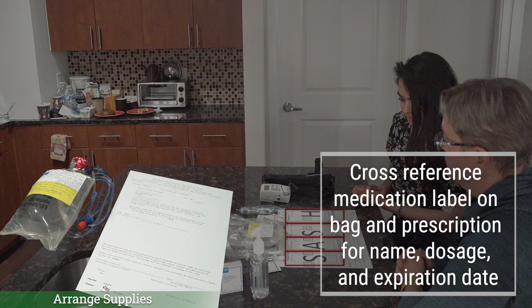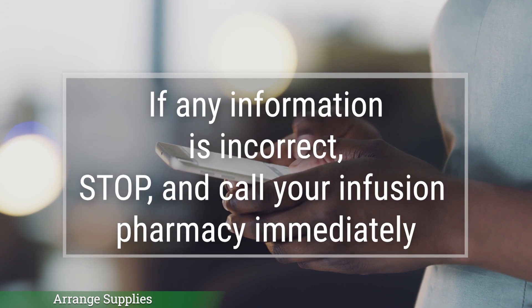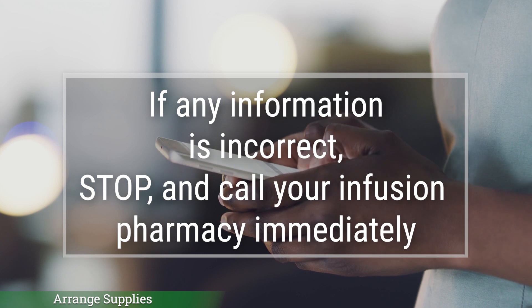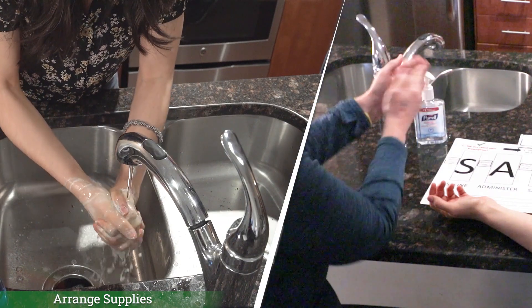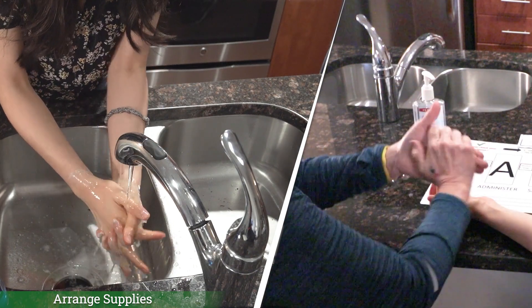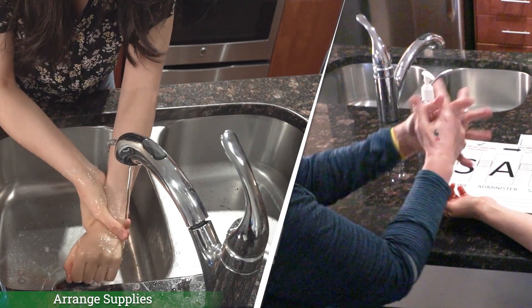Now, check the label on the medication bag and compare it to your prescription. It is always important to check the medication label on the bag to make sure that your name is correct, the medication and the dose of medicine is correct, and that it matches what is on the prescription. Look at the expiration date or the do not use after date on the medication label. If any of this information is incorrect, stop and call your infusion pharmacy immediately. Now, wash your hands for 20 full seconds. If sanitizing, you want to always get a good amount in your palm, then rub until dry.